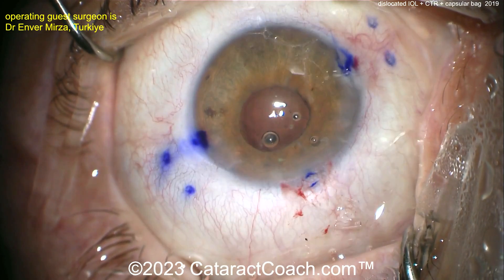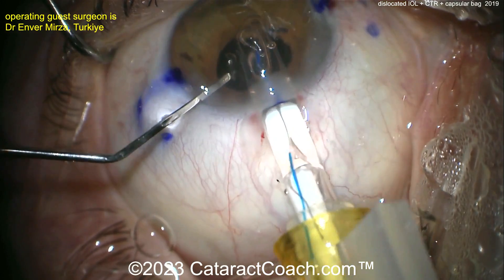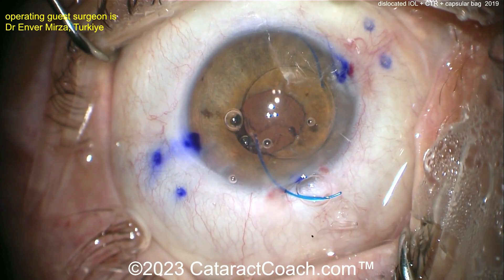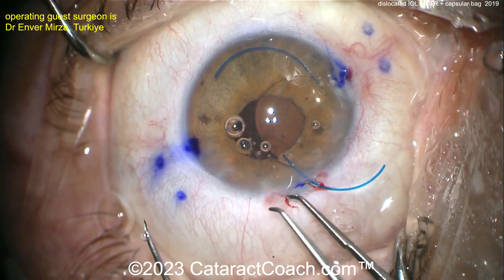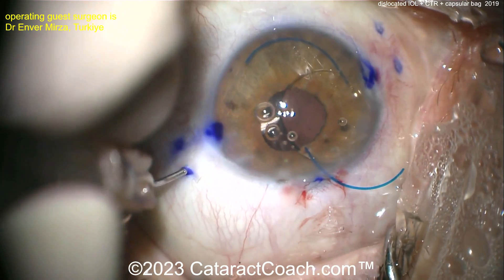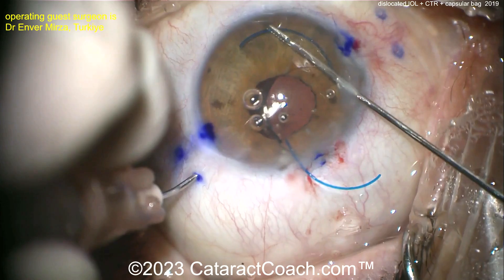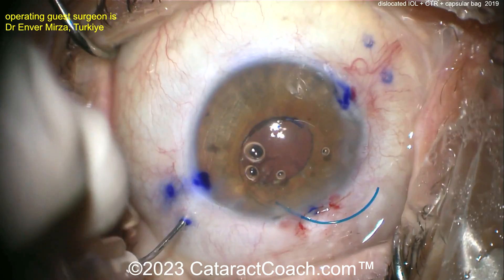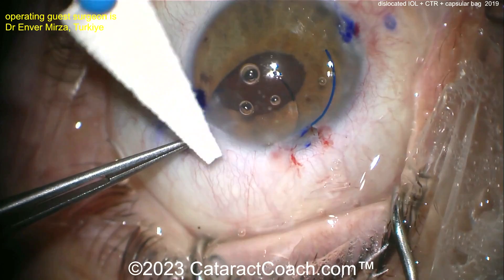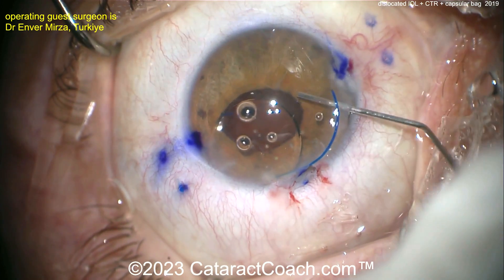More triamcinolone can help stain again. Now for the Yamane/Imani technique — putting the IOL in. There's the leading haptic, the optic, and the trailing haptic. Here comes the 30-gauge needle with a good length of tunneling in the sclera, then entering — very nicely done. Using the micro forceps to feed the haptic. The lens is repositioned into a favorable position. There it is — externalized very nicely, and done without too much manipulation into the vitreous. A little flange is being created with cautery.